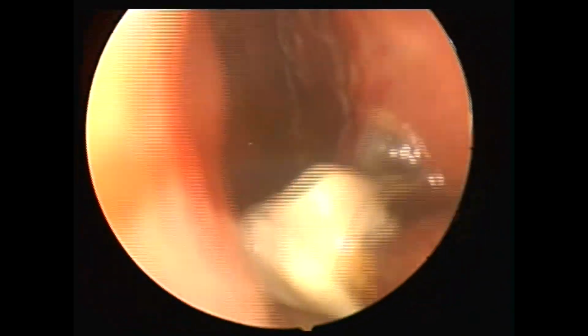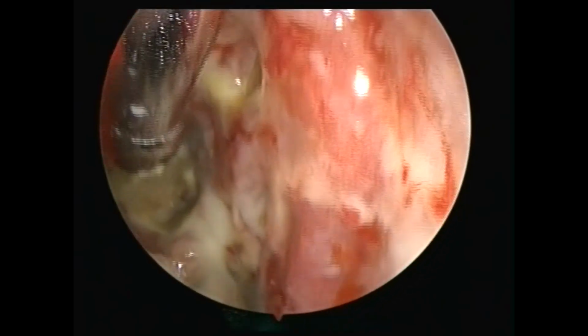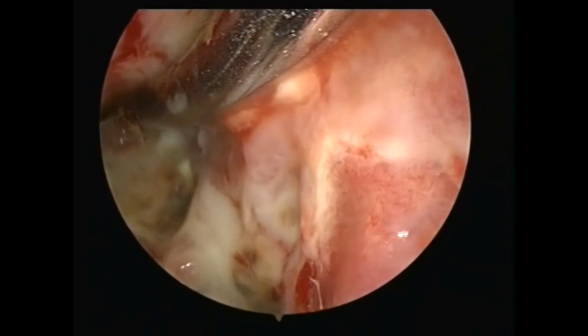You can see all that crust and scab and fungal debris coming out. This patient had a very severe load. I'm just trying to show you in this video, if any surgeon out there is trying to perform a surgery of AFRS, how to maintain and take care of the patient post-op.